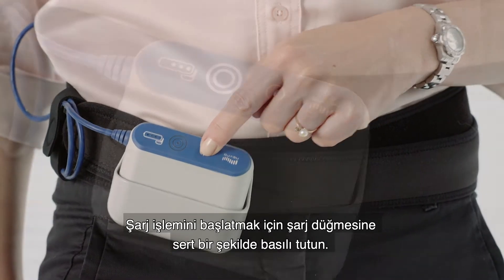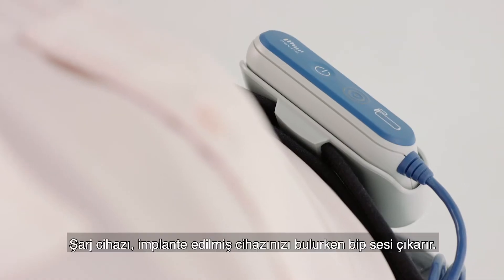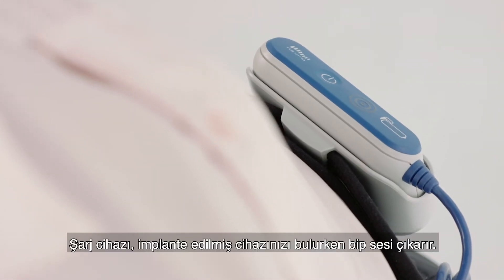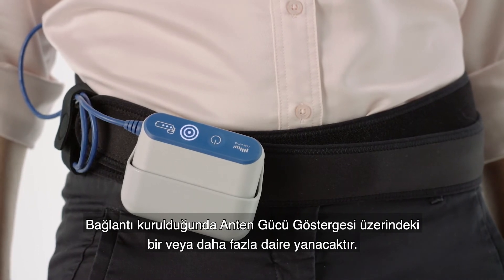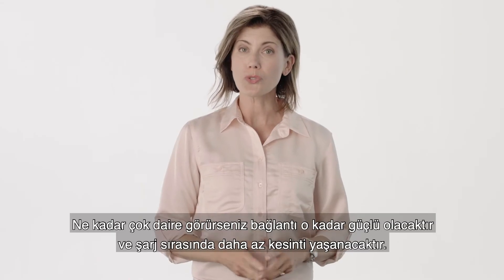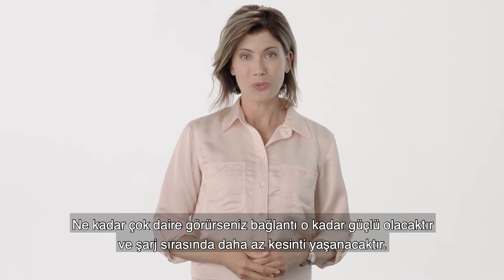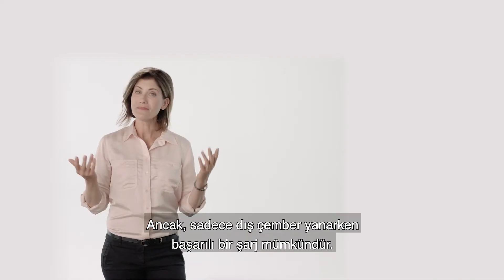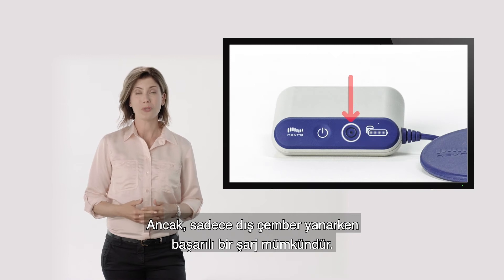Firmly press and hold the start charge button to start a charging session. The charger beeps while it is locating your implanted device. When connection is made, one or more circles on the antenna strength indicator will illuminate. The more circles you see, the stronger the connection and less chance of interruption during charging. However, charging successfully is possible with just the outer circle illuminated.